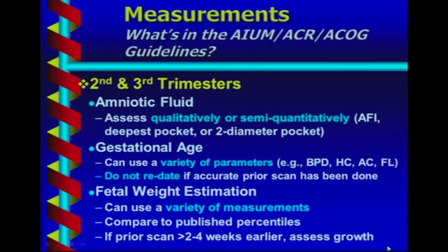And fetal weight estimation should be done, especially in the third trimester, and a variety of measurements can be used to estimate the weight. And the fetal weight should be compared to published percentiles.